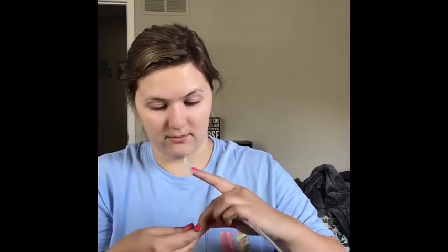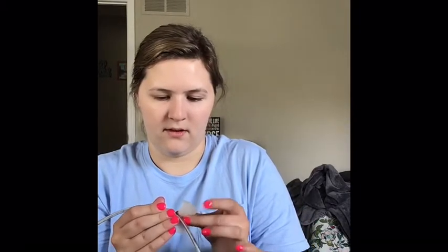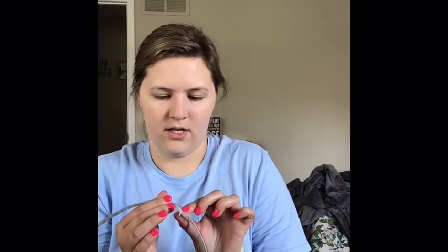So I'm going to go ahead and flag a piece of tape there, just so I know. Wait, hold on, let me redo that. I feel like it's easier just to use Sharpie, but sometimes that can be hard to see. All right, okay, that's better. I have it flagged now.